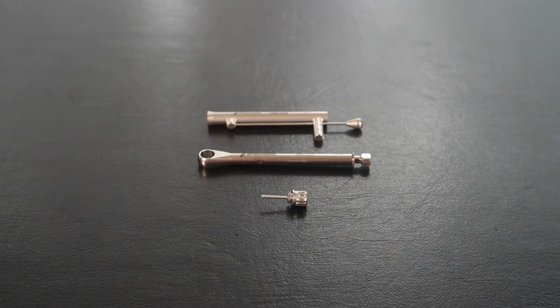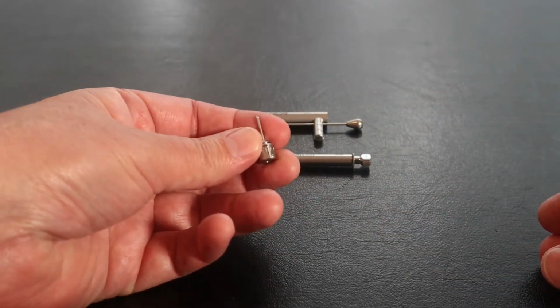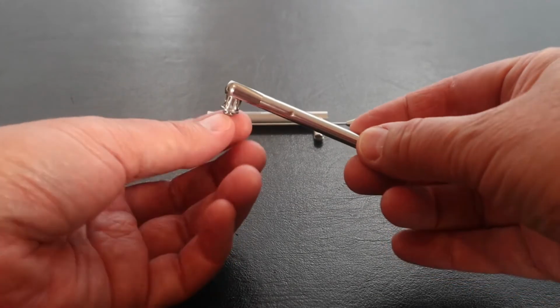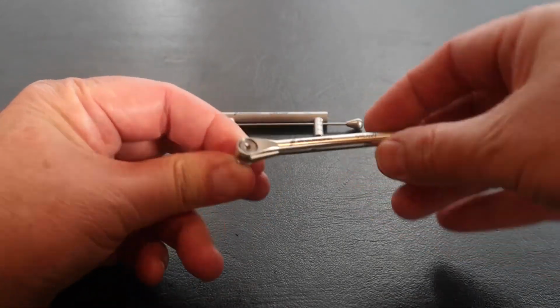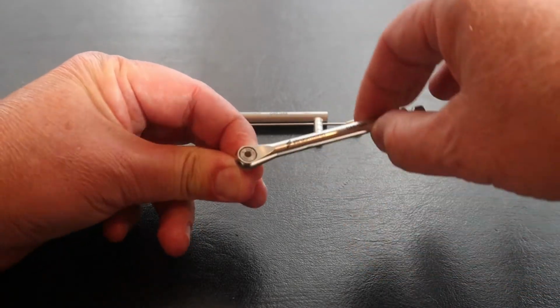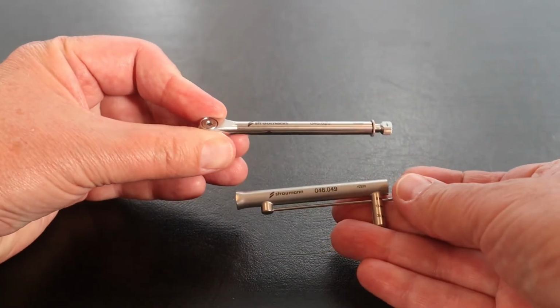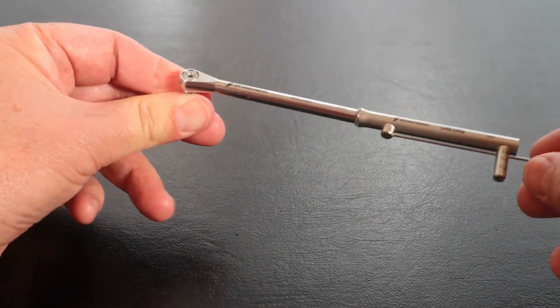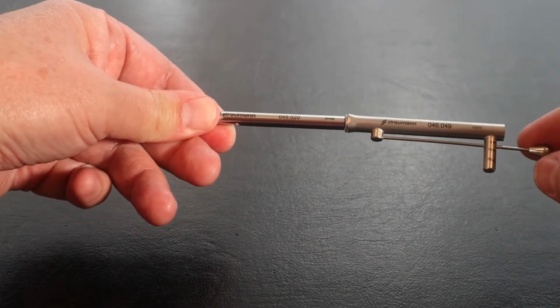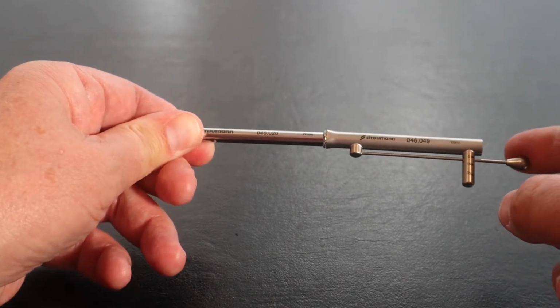So this is my newest torque wrench, ratchet, and driver assembly for a brand of implants that I haven't worked on before. So it's kind of interesting. It consists of the driver and the ratchet handle, and so the ratchet just slides in, you pull this out, fits on the head, and now you can ratchet to tighten a screw up. And once you have it down all the way, the torque wrench part of it just slips on the end. You have the driver in the screw, and you just press down on the beam and you can apply torque. And it goes from 0 to 35 Newton centimeters.